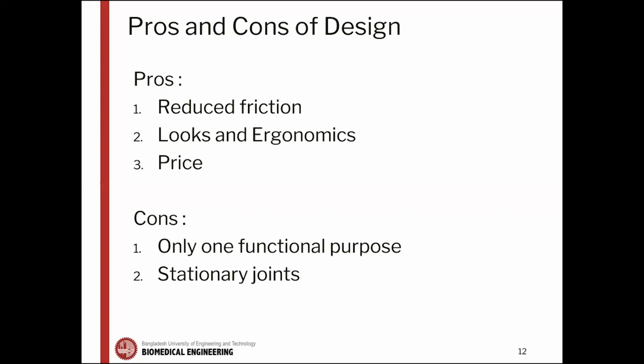The entire functionality of the prosthetic is in theory right now. So we will need to materialize it to actually test the functionality. We have considered some of the joints to be fixed, so the prosthetic will not be able to perform some other basic movements where there are wrist movements included.